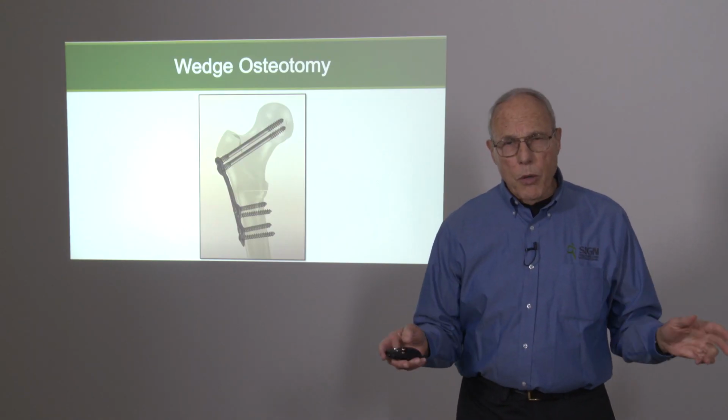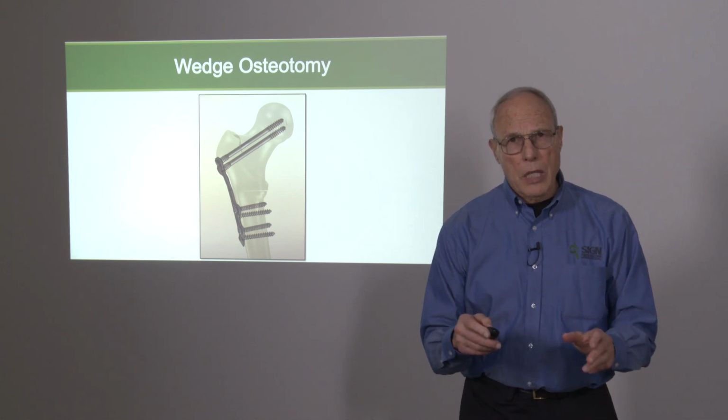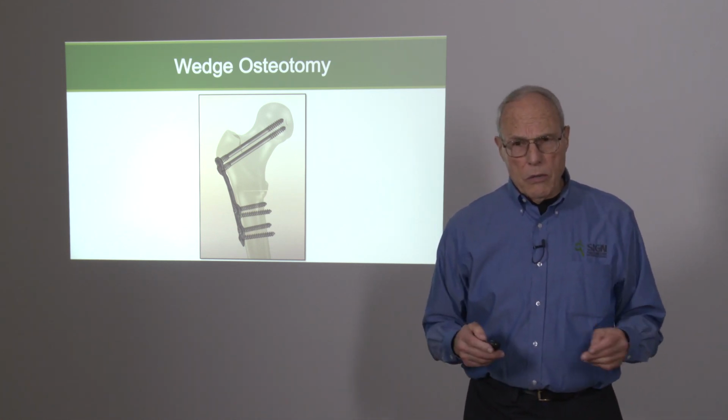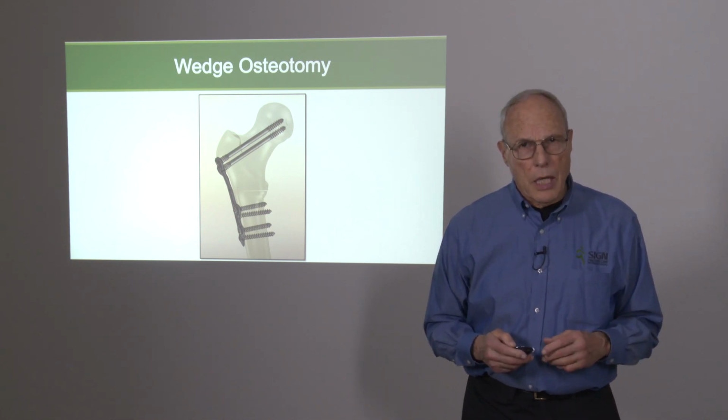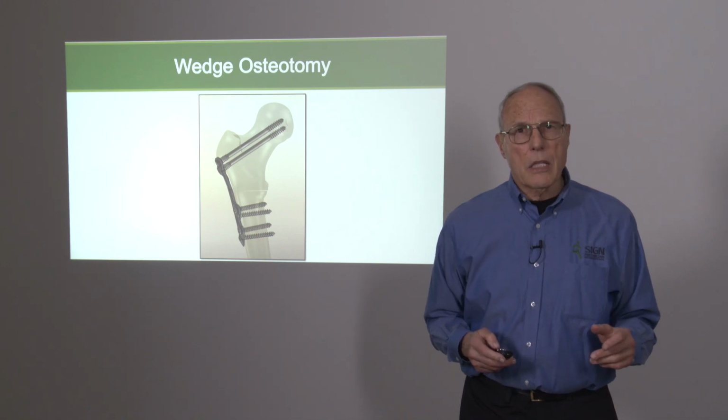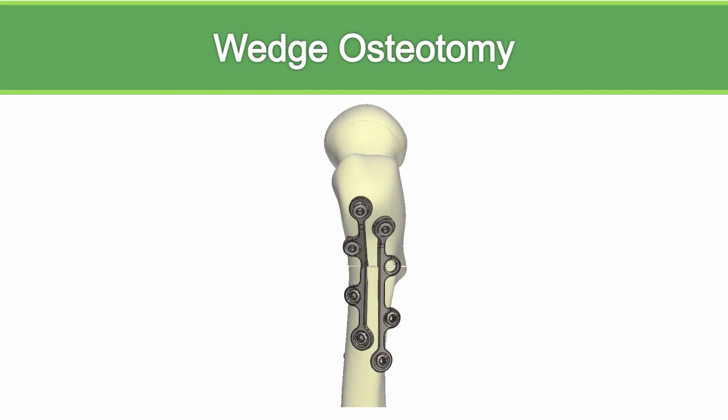We hope you'll report these because this is a new technique. It follows the principles of all valgus wedge osteotomies and uses the SIGN instruments and implants. This is what the implants look like on the lateral view.